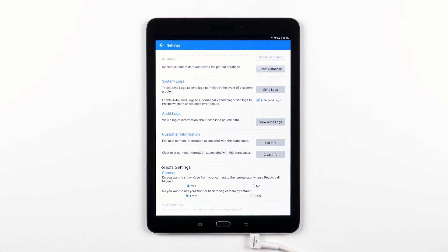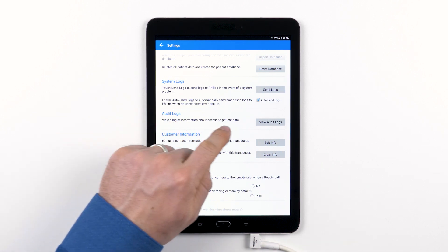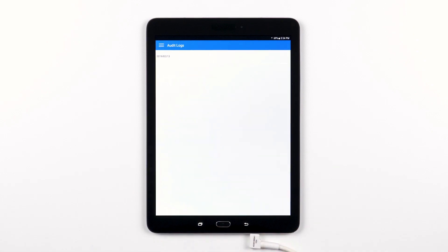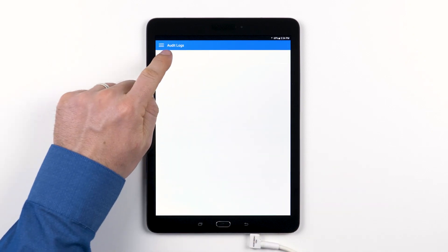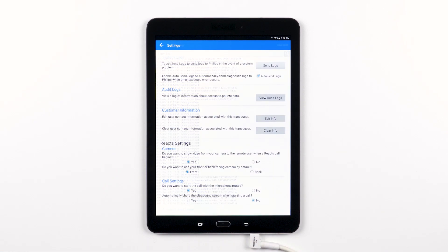The Lumify system keeps a record of when patient data has been accessed. You can view that record in the audit log section. Tapping on one of the dates listed allows you to see more information about what took place on that day.